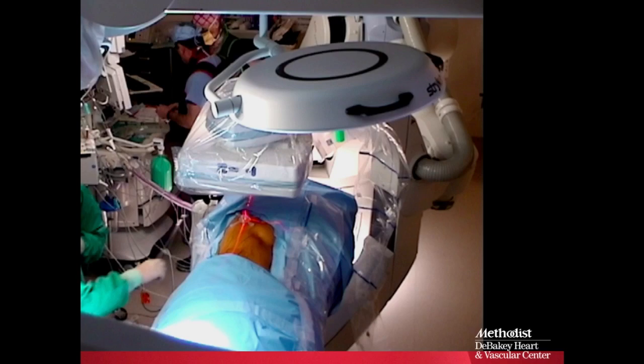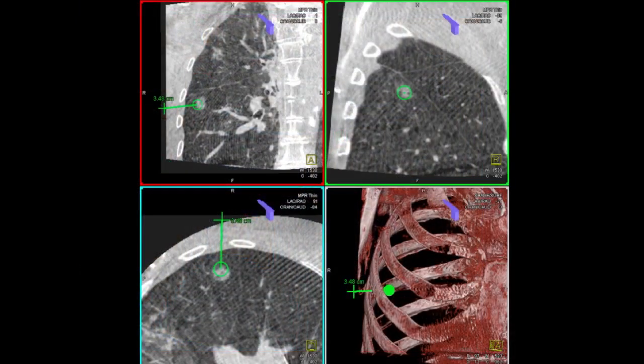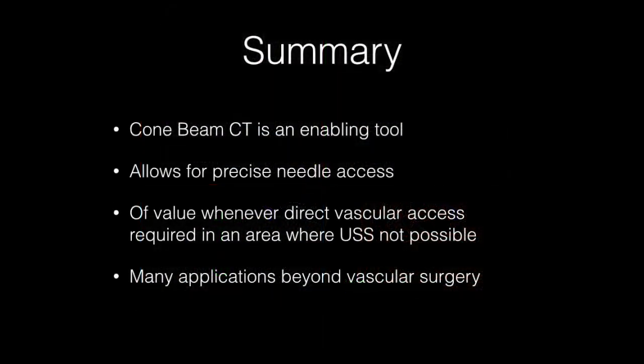Here we're actually localizing the lung nodule. This is what the workstation for the lung nodule actually looks like. We dropped an embolization coil into this and the surgeon then took it out.